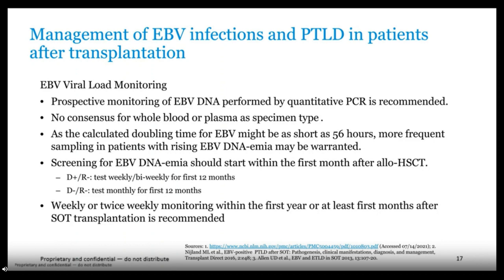Let's move on to EBV and PTLD. So EBV viral load monitoring is done primarily as an early indicator of those patients who may develop post-transplant lymphoproliferative disorder. So prospective monitoring of EBV DNA is performed again by quantitative PCR. There's no consensus on the specimen type here. Many labs are still using whole blood.